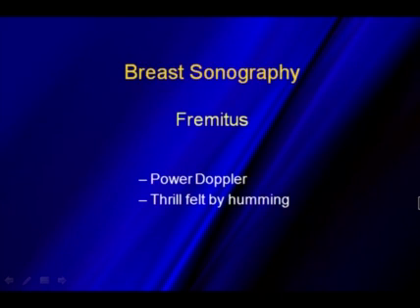The last thing I want to talk about is fremitus. Fremitus is done with power Doppler. If you look up in the dictionary, fremitus is a thrill felt by humming. So what you want to have the patient do is hum. A lot of times patients do not like to hum, so you kind of have to hum along with them.